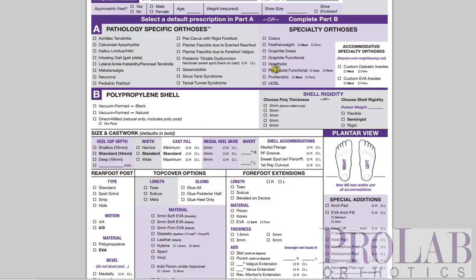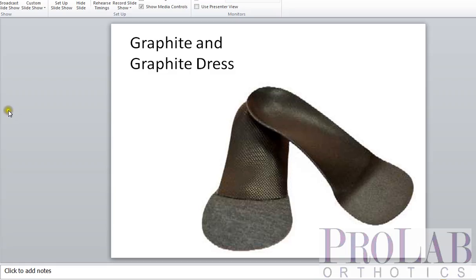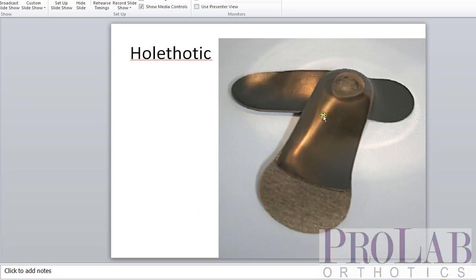The next device is the Hole Thodic. This is a polypropylene device with a standard width, a standard cast fill, and a shallow heel cup. It's called the Hole Thodic because we actually grind a hole in the heel. One nice thing about polypropylene is you can grind right through it and it does not weaken the overall material. This allows it to sit very low in the shoe. Much like the Graphite orthosis, it is a great device for flats for both men and women.